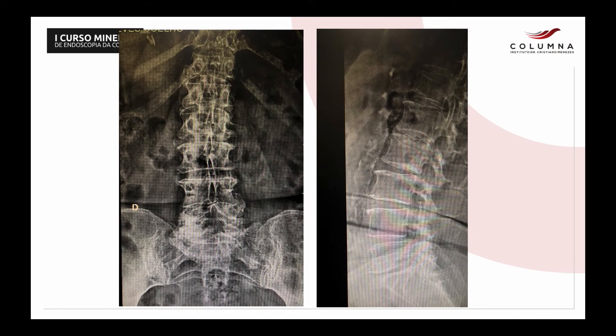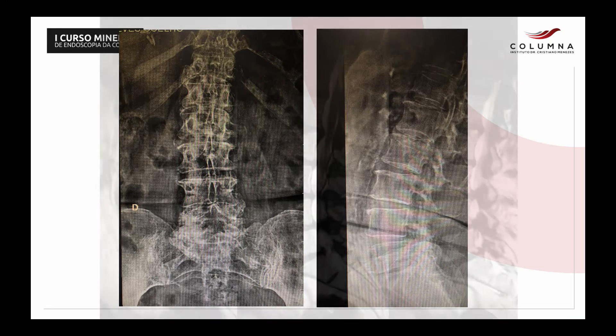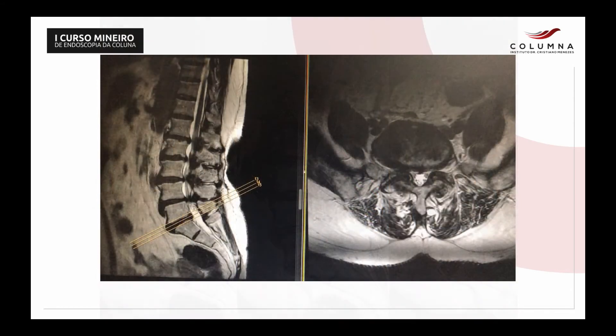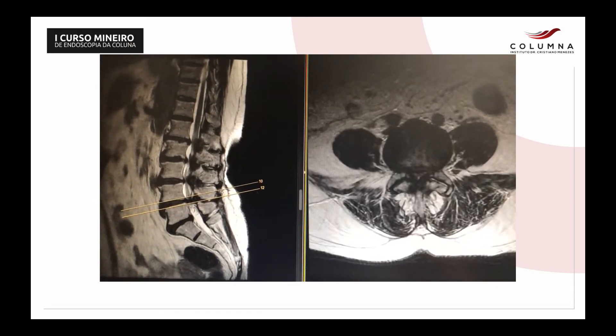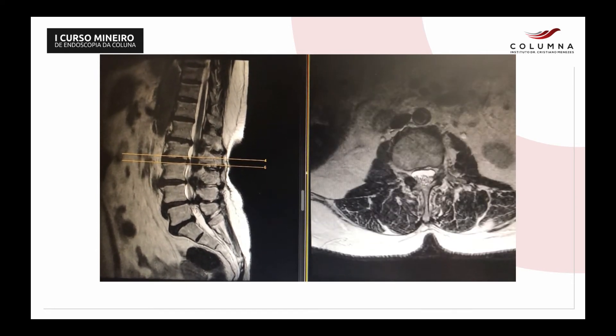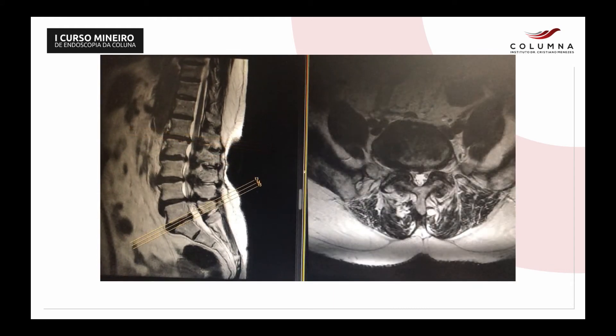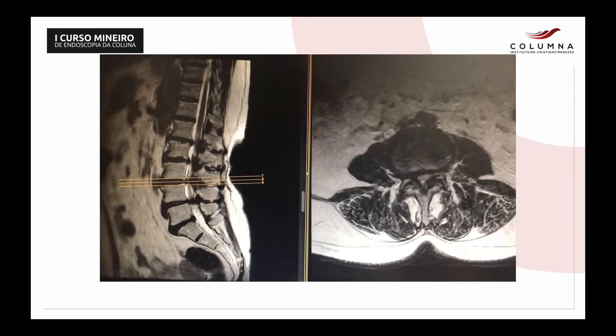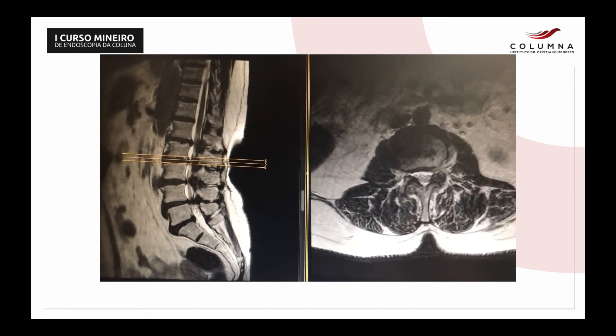Now I'll bring a multiple-level case just to illustrate our lecture. This is an 80-year-old lady with arthrosis in the hips, knees, and spine. In the sagittal MRI we see that the canal is very stenotic, especially at L3-L4 and L4-L5. This video shows dynamically the decompression at L4-L5, then L3-L4, and L2-L3 and L1-L2 not so compressed. So we decided to decompress the two worst levels, L3-L4 and L4-L5.